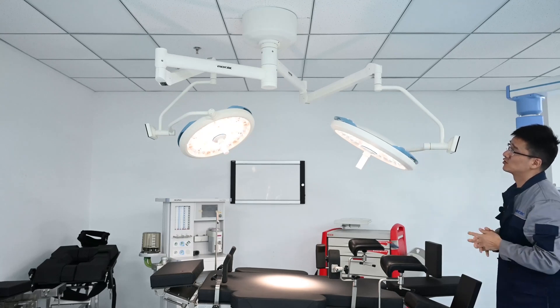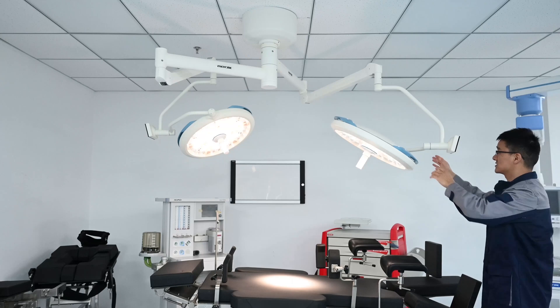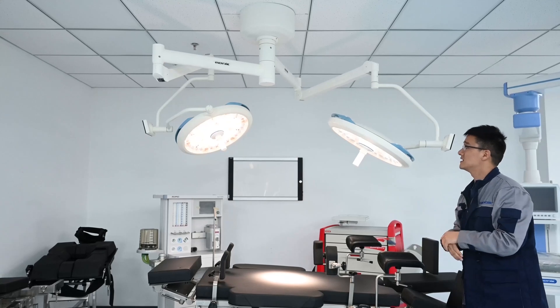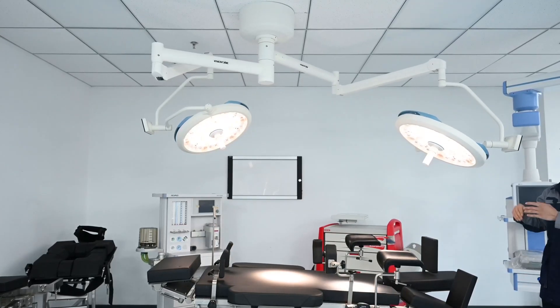The spring arm has a good feature: it will not float after you position it. This light has been installed here for two years, and with daily operation it still holds the lamp firmly after you stop moving it.